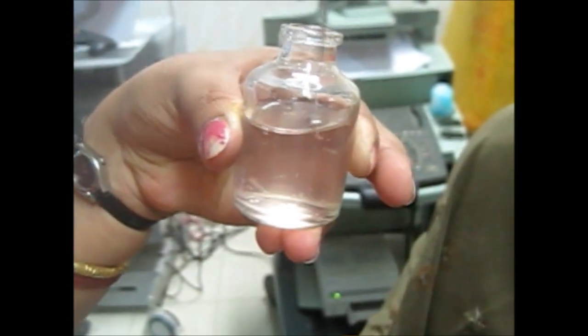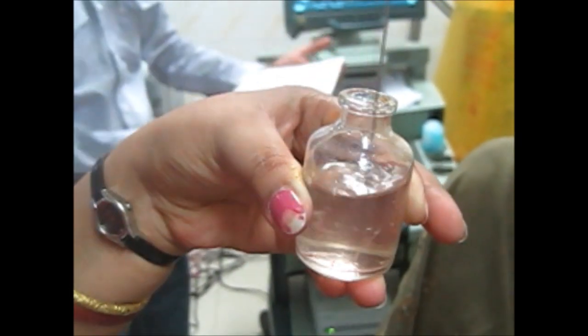You have to press this button and the biopsy has been taken. We will remove this — you can see the tissue, red in color — and now we will put it in the formalin.